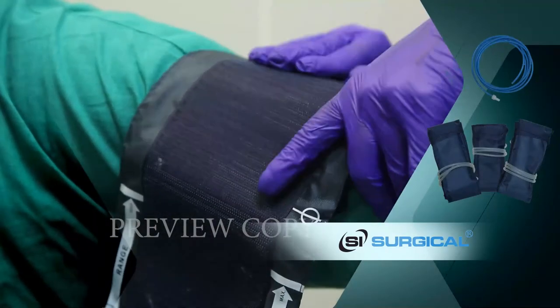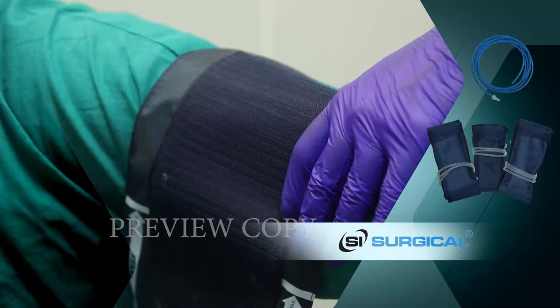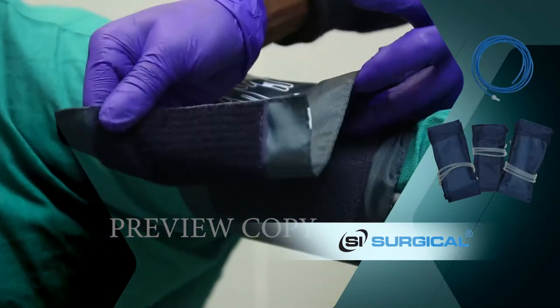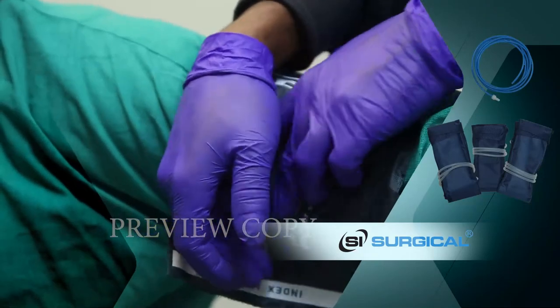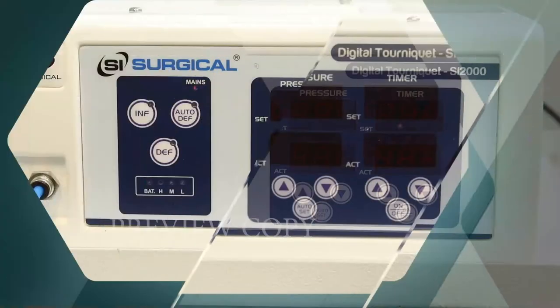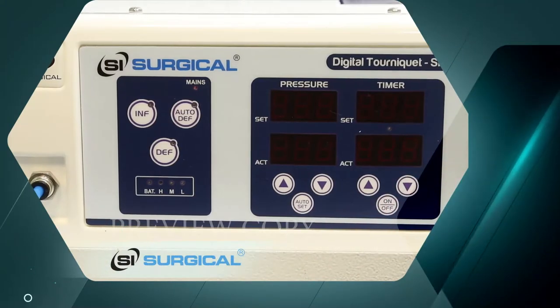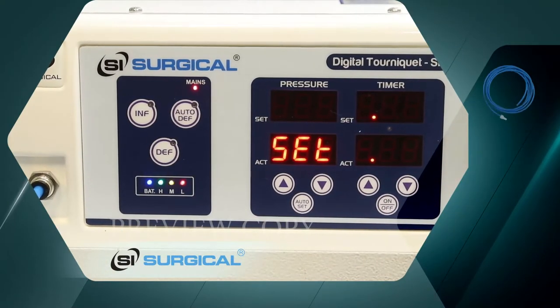We attach the cuff to the patient's arm. Let us now demonstrate the function of the machine. This is how the machine starts.